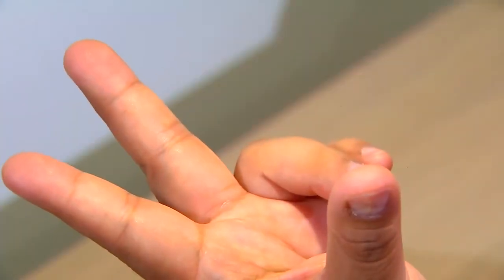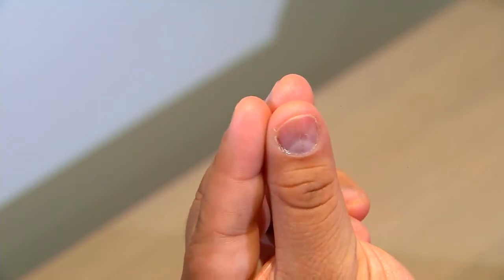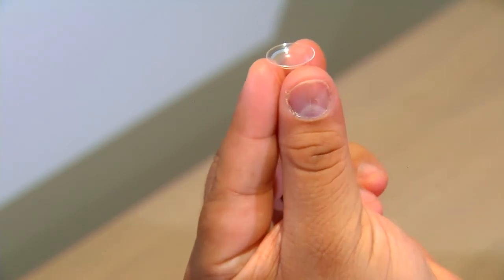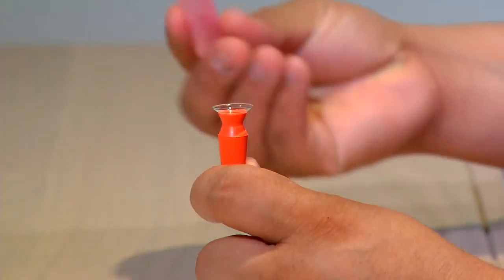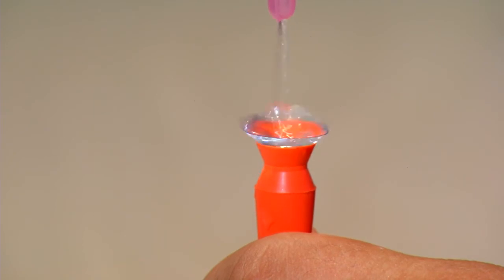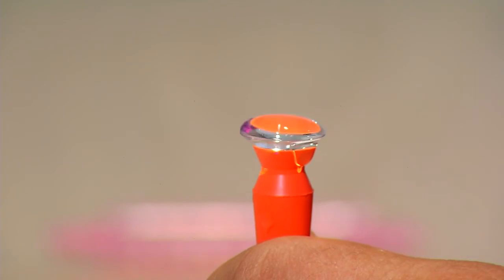The fingers alone can also be used to position the lens for application. Place the thumb, index, and middle fingers together to form a tripod. Balance the InSight Scleral Lens in the middle, fill it with fluid, and apply it to the eye. The common denominator for any method of application is to make certain that the lens remains horizontal and filled to overflowing with the recommended solution.